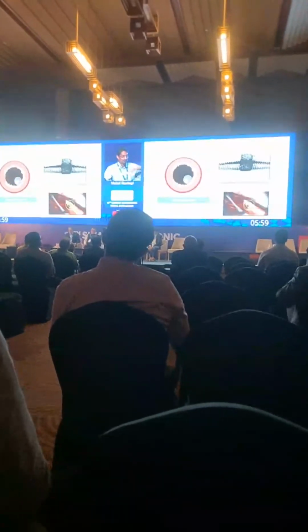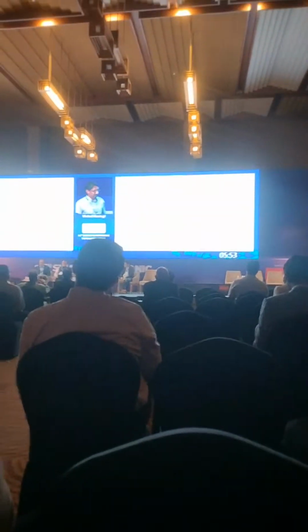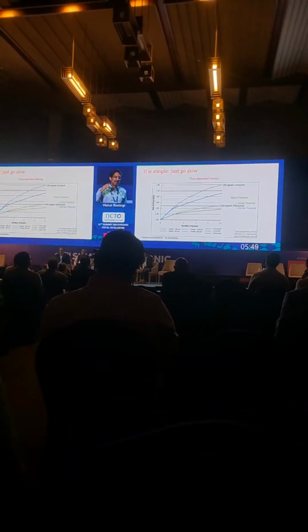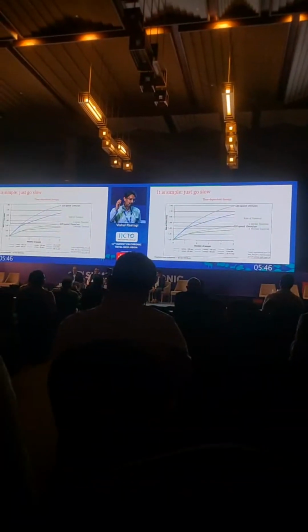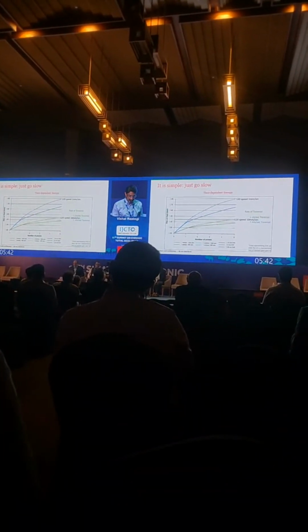Calcium nodule, orbital atherectomy has a much larger chance of ablating that also. It's very nicely shown by Dr. Kwasi that it is very important to go slow. Otherwise, you would be just missing lesions. If you go fast like rotablation, you would be missing lesions in between, and you will not gain the lumen also.